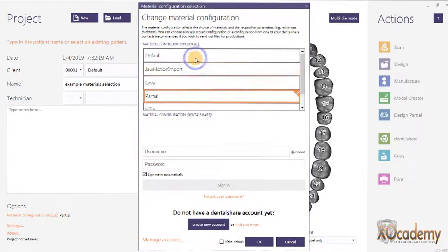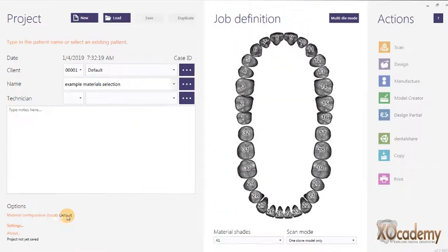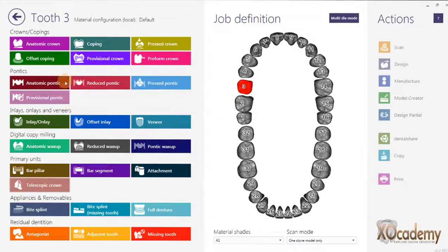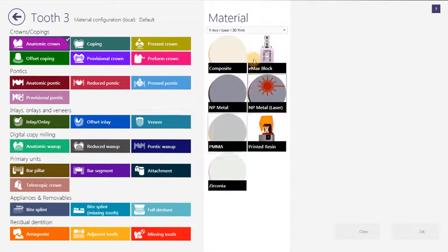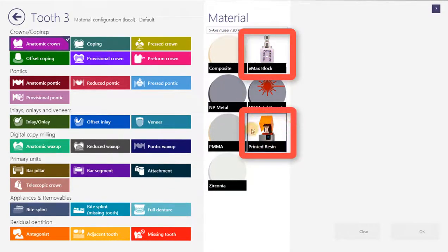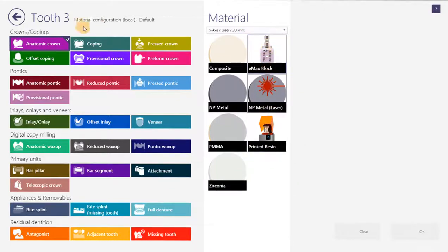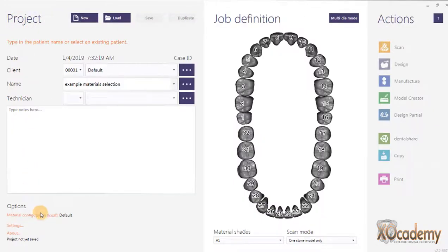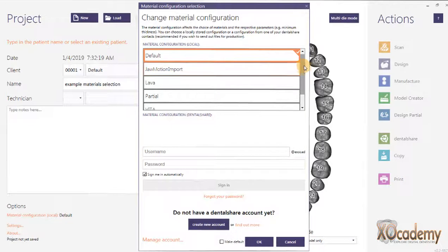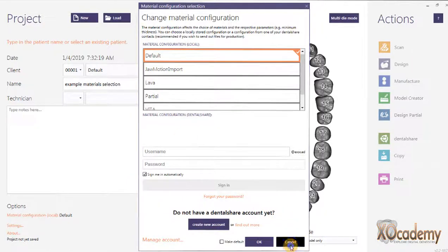With mine, I'm going to go back to my default material configuration and click on tooth number three. Let's say I'm doing a crown. You can see for my materials I've got eMax blocks available and resin available — these are separate settings I have for these types of restorations. That's how you change the material XML file, by going down here to material configuration and selecting the correct one.